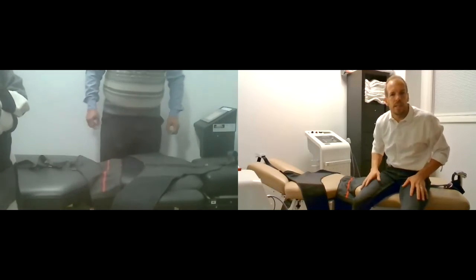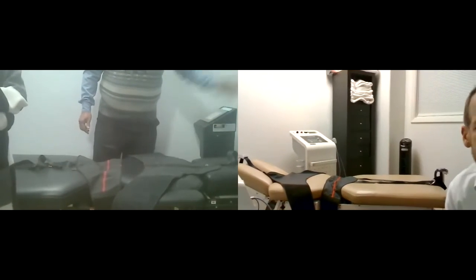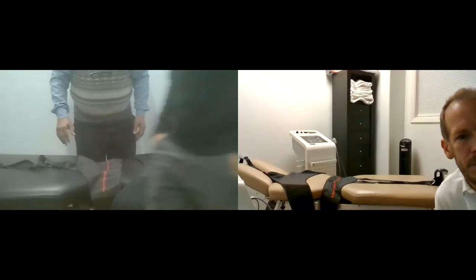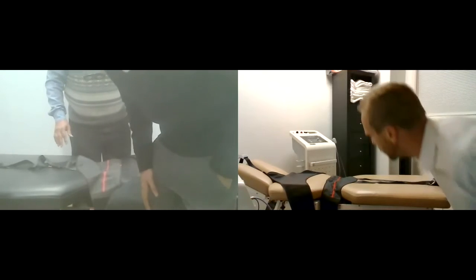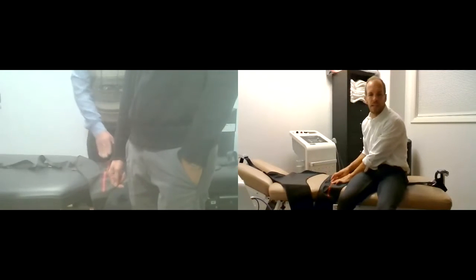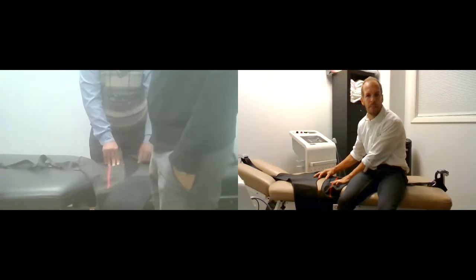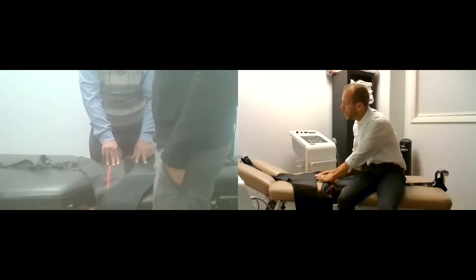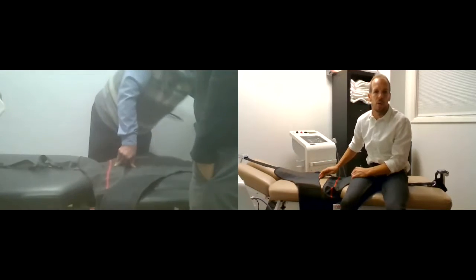So let's treat. Can we treat the young man that's there? Because he'll be an easy one to set up. How tall is he? 5'7". Okay. So 5'7", we're going to put this red line right at the bottom of the thoracic cushion, and we're going to have probably about a 2-inch gap here. Once you have your gap, pull this tight up here so that it is not going to move. Now it's exactly where we want it.